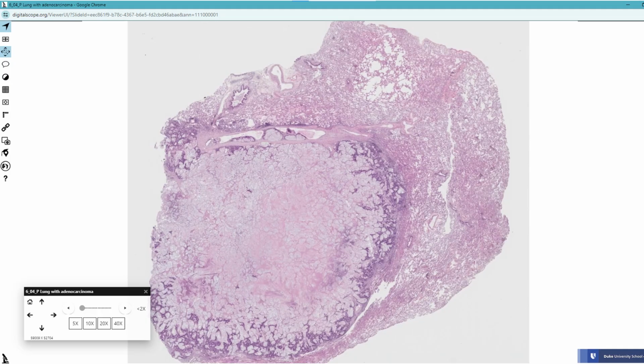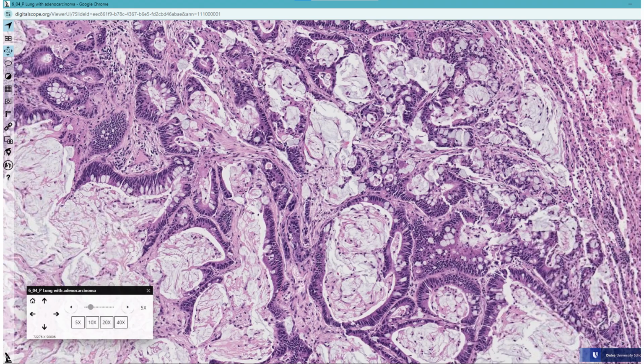And the next one is lung adenocarcinoma. So you can see there's lung tissue with a tumor there. When you focus inside there, you can see these are malignant glands, because they are very irregular, and you can find all the five features of malignancy there. You can see it is hyperchromatic, pleomorphic, with a high NC ratio, and some of them having mitosis as well.